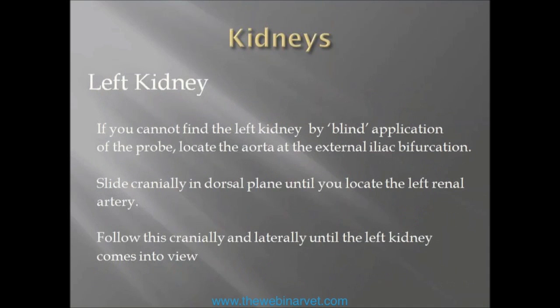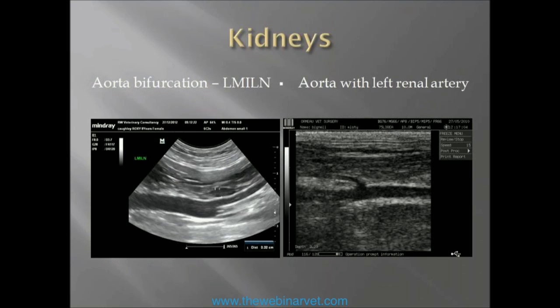In terms of finding the kidneys, if you can't find the left kidney by blind application — which is how a lot of people start — the way you should learn to do this is by locating the aorta at the external iliac bifurcation, then sliding cranially in a dorsal plane on the body until you locate the left renal artery. Once you've found this, you follow it from the aorta cranially and laterally, and the left kidney will come into view.